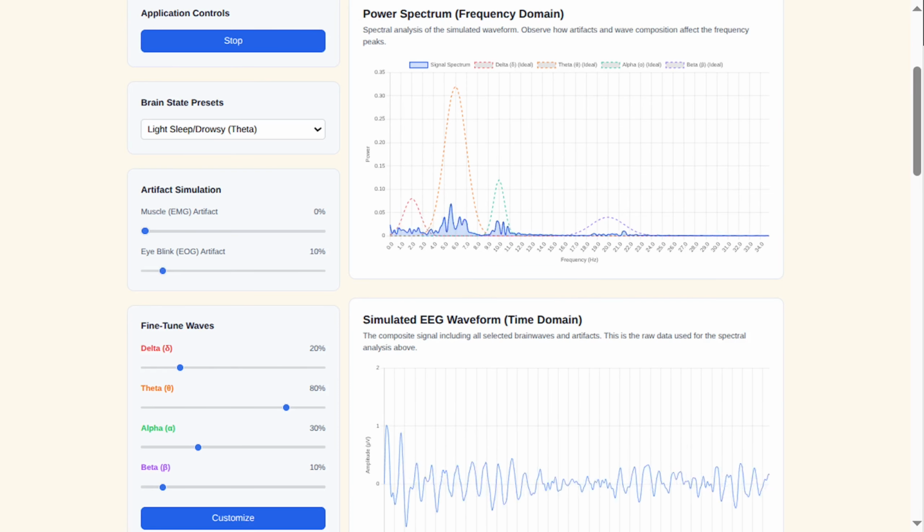Okay, can we go back to where EEG can be recorded from? EEG, or electroencephalography, is recorded from electrodes placed on the scalp. These electrodes detect electrical activity generated by neurons firing in the brain. This technique is non-invasive, meaning it doesn't require surgery, and it's widely used for monitoring brain activity in various fields, including neuro-rehabilitation, epilepsy research, and brain-computer interfaces.